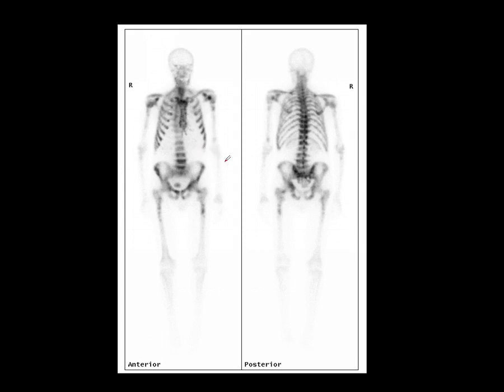So it's called, as I said, I don't know whether it's called superscan or superscan. Different people say different things, but I'm sure both will be correct if you should use the terms.